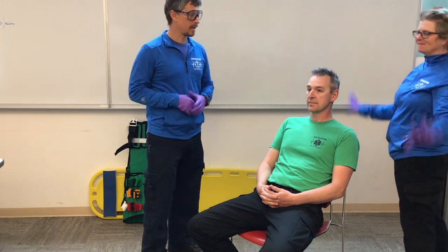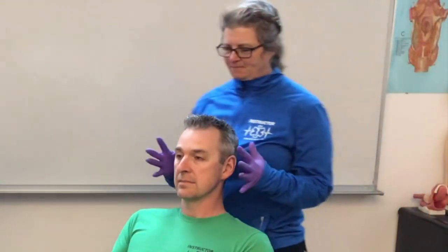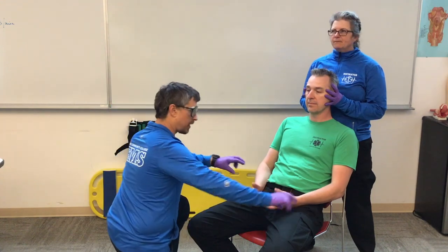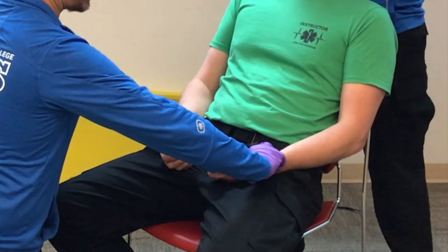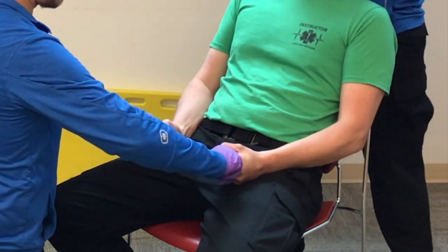My partner Cindy will have her proper PPE on as well. I'm going to start by having Cindy hold Chandler's head in a neutral inline position and maintain that. Then I'm going to check my CMS — I want to compare my pulses. I've got equal bilateral pulses. Can you go ahead and squeeze my fingers?